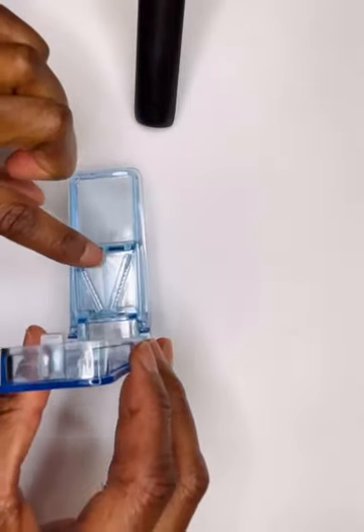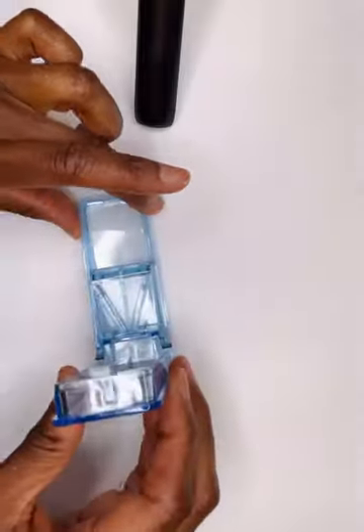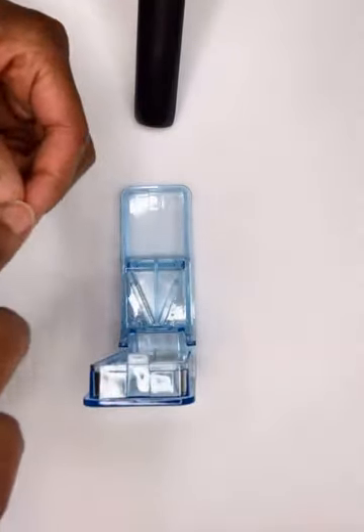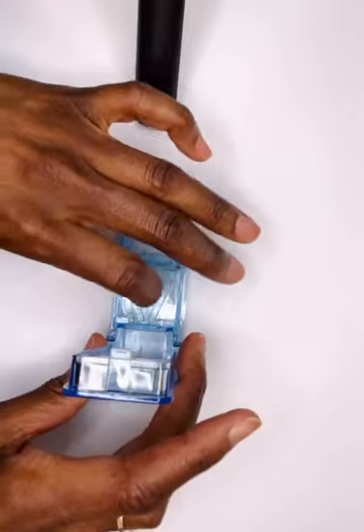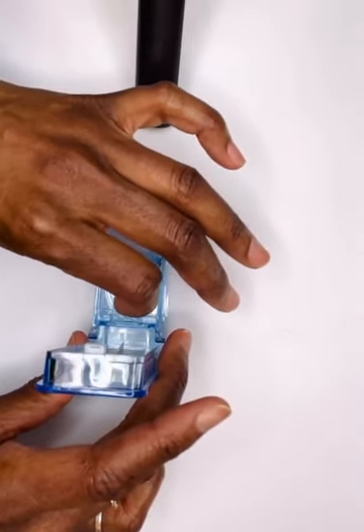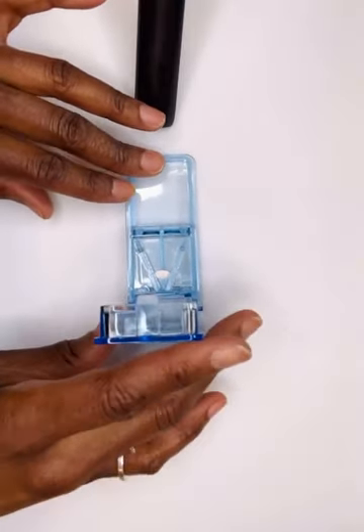What you're going to do is I'm going to demonstrate this, but you'll put the pill right here and then you'll bring the pill cutter down to cut the pill, okay? So here's a much smaller pill. You can see that it's scored as well. What you do is you take it and you put it in, okay? You basically kind of fit it down. And sometimes you just may have to rejigger it so it gets in the right place. Okay, so you see how you got it there and it's in the middle of the V.